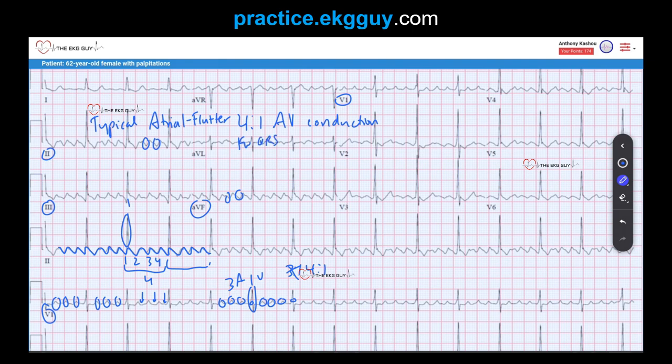The most common AV conduction ratios in atrial flutter tend to be even ratios — 4 to 1, as in this case, and 2 to 1 is also common. Variable AV conduction can also occur, where you might see 4 to 1, then 2 to 1, then 3 to 1 — that's called variable AV conduction. It's also possible to have complete heart block (third-degree AV block) with atrial flutter as the atrial rhythm and a junctional or ventricular escape rhythm, though that is not the case here.